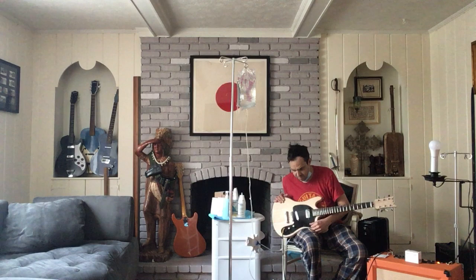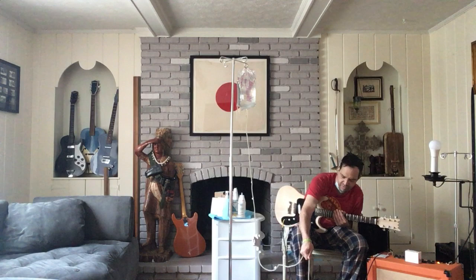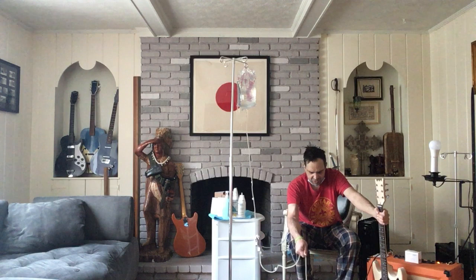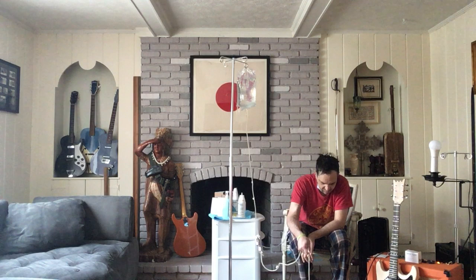All right, so it's still dripping a little bit. And usually you can move yourself around. Kind of squeeze your abdominal muscles a little bit. Don't squeeze too hard. You don't want to herniate or anything. I mean, where that port goes in, you don't want to herniate that. That would be a disaster. Still draining.